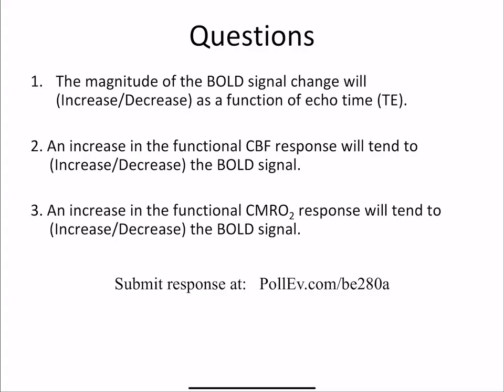Okay, so remember back to our original image where we showed the results from Seiji Ogawa, where did you see much BOLD signal at an echo time of 8 milliseconds? No, right, it was sort of flat. And then as we increased the echo time to 40 milliseconds, you started seeing signal, right? So that would tend to tell you that the magnitude of the BOLD signal change will increase as a function of echo time.